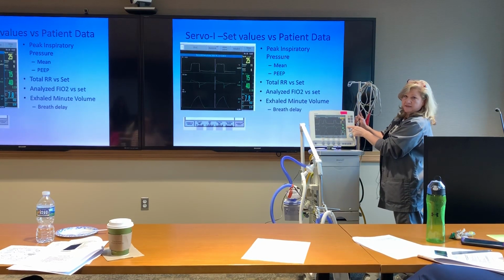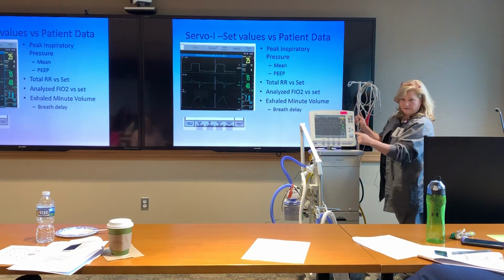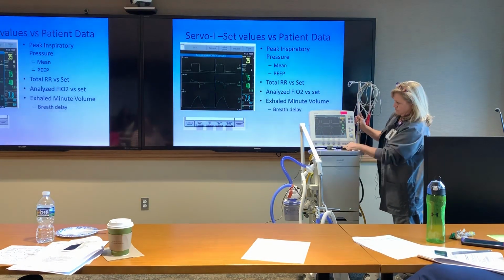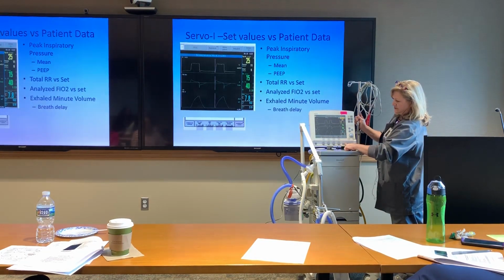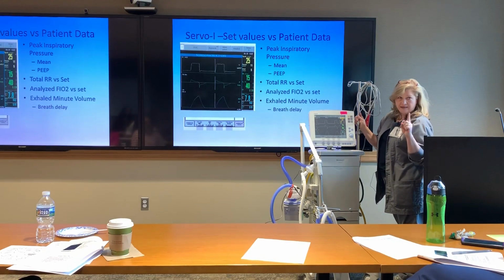This will take a few breaths to get up to 100, all right? Look here, and you'll know whether or not you hit it, okay? Because sometimes you might think you hit it, and you're not sure. So you hit it again, and then it goes right back down to what it was before. So just hit the button and look here, all right? Should change to 100 right away. If it does, it'll give you 100 for 1 minute only.